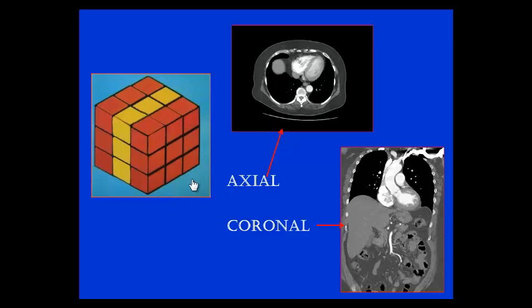It's digital information, so we're going to be looking at slices. And if we look at our diagram here, if we get slices in one plane, to tell the computer to make a slice using that data into another plane is not really that difficult. So our data is generated really from these transverse slices that cut across the long axis of the patient, but we can tell the computer to make another slice in another plane, and here we're looking at a coronal slice, as though our friend was staring here looking out at us, somewhat like a chest x-ray with the heart in the middle and the lungs on one side and the other, and maybe some liver in there. So that digital information allows us to get multiple images.